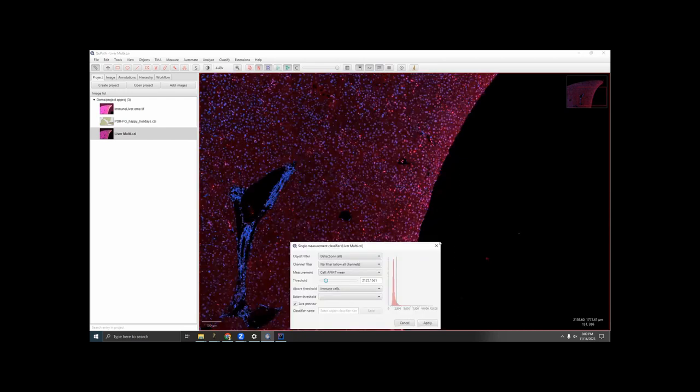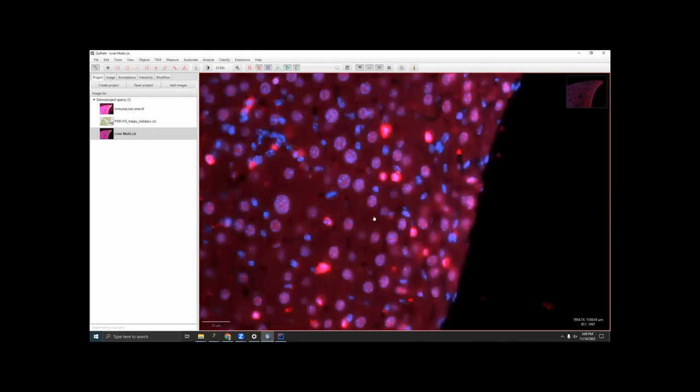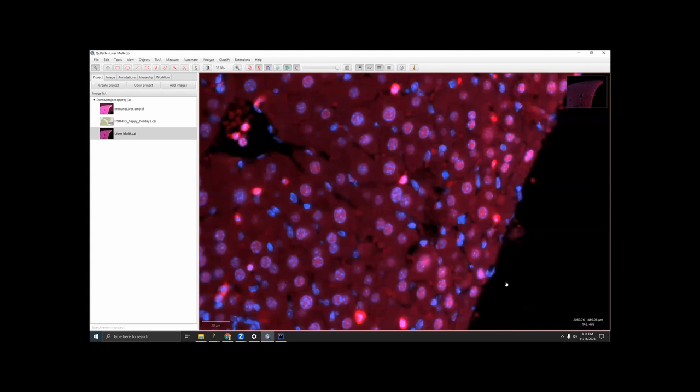So the way we're going to have to deal with this is to find a way to account for this background staining and either subtract it or divide it out from each cell's measurements. This is actually the same problem that Zbigniew mentioned in his artifacts video. And there he talks a little bit about how to remove this edge artifact through proper fixation. Fixing the tissue preparation in the first place is always better than trying to quantify your way around an artifact, but we don't always have control over sample prep, and sometimes you just have to work with what you've got. All right, so we need to write a script that gets rid of this background artifact.